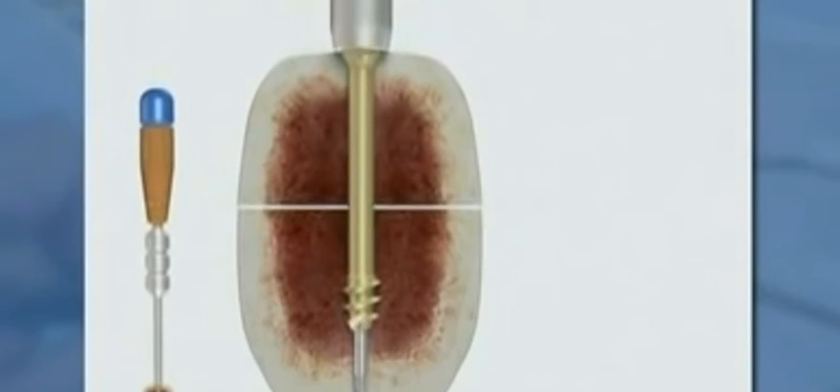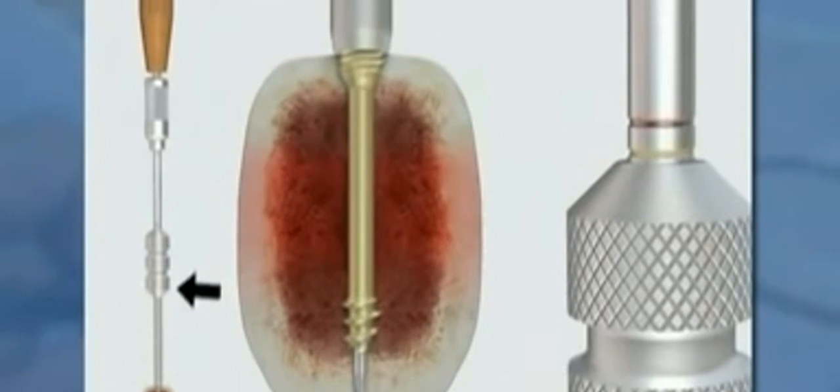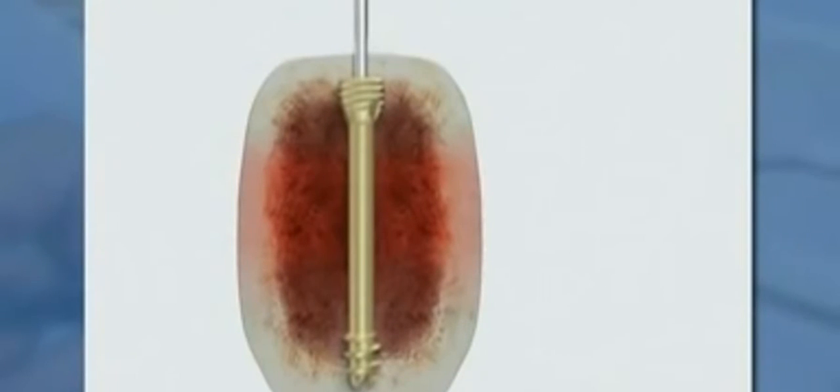Further rotation of the sleeve will first close the fracture gap and then compress the fracture fragments. When the appropriate compression has been achieved, the handle of the compression sleeve is removed. Then the cannulated screwdriver is inserted into the compression sleeve. After the cannulated screwdriver has been correctly seated in the screw head recess, the green mark of the screwdriver shaft will be visible at the top of the compression sleeve. While firmly holding the compression sleeve, screw insertion is continued with the screwdriver. If the screw is countersunk until the yellow mark is visible, it will be flush with the bone surface. If the screw is countersunk until the red mark is visible, it will be seated 2 millimeters below the bone surface. It should be noted that compression can be achieved only when rotating the compression sleeve. No additional compression is generated during countersinking. The screw is simply advanced into the bone while compression is maintained by the compression sleeve.